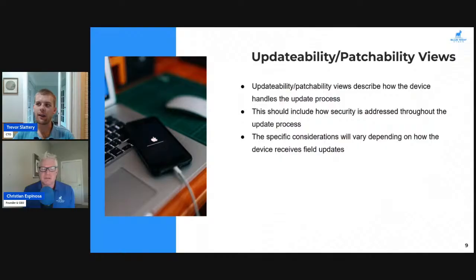In general, there's a little bit more that can go wrong with over the air updates since you have to consider security for that over the air infrastructure as well. Usually that's a cloud hosted update server, and that can be compromised. The compromise and the downstream effects of that server can be massive. So yeah, there's a higher risk. Obviously, there's a higher benefit to it as well.